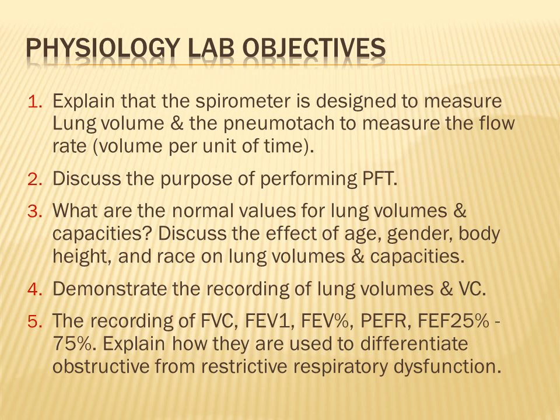The second objective is to understand the purpose of performing the pulmonary function test. You need to know as medical students the normal values for the lung volumes and capacities, and we already took that in our theoretical lectures. So please refer back to the values that have been discussed and demonstrated in the theoretical lectures. Also, you need to know the effect of age, gender, body height, and race on lung volumes and capacities.